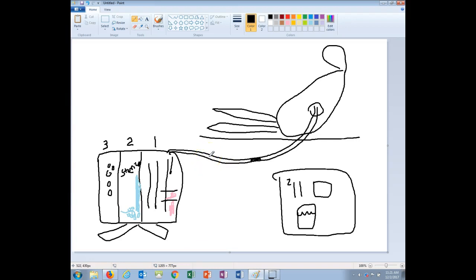If the chest tube drainage system itself is compromised, you want to immerse the chest tube here into sterile water to help restore the water seal until you can replace the actual drainage system.